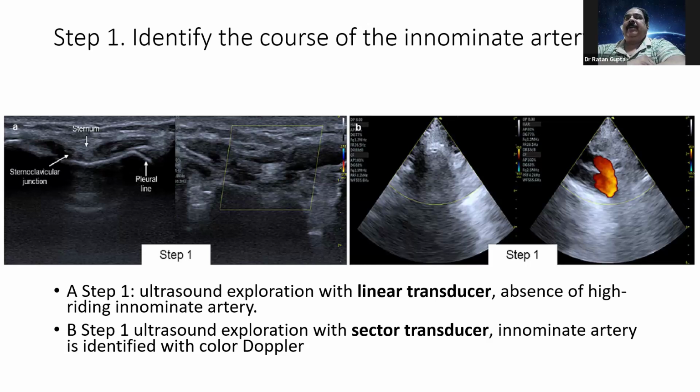Yes, sir. The only thing is sometimes when you're holding the needle and the syringe with the air and trying to coordinate it with the probe as well, that becomes a little difficult. Maybe just taking the needle under without the syringe might help improve it.